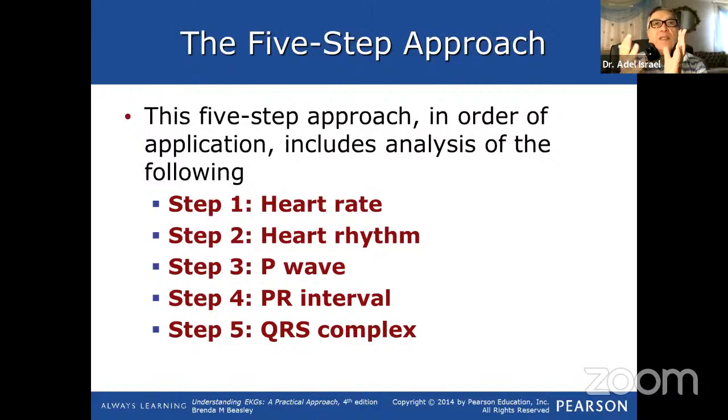And what will be the guide for me to tell if this is regular or not? I'm not going to listen to the sound with the paper. So how can I detect that this is regular or not regular? If I find the distance from R to the next R, to the third R, to the fourth R, the distances are equal, almost equal.